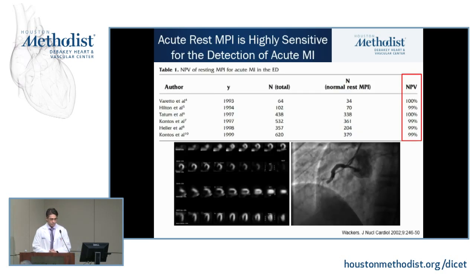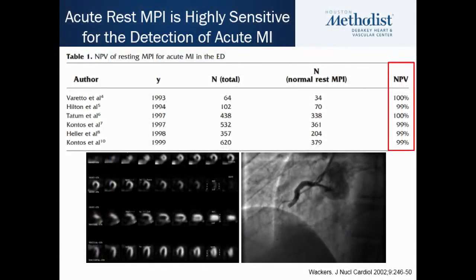So let's begin with, historically, one of them. This was rest myocardial perfusion imaging. I don't imagine you have seen these studies. I can't remember the last time it was ordered in the reading in the nuclear lab, so I don't think any of y'all may have seen these studies. I remember doing this when I was a fellow on a few patients.